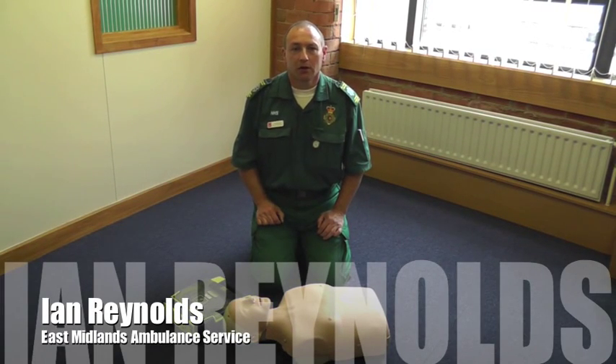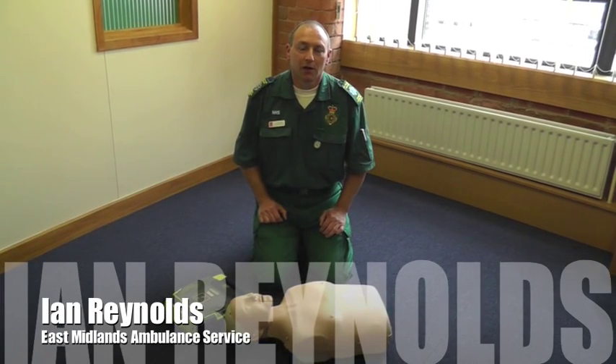I'm going to demonstrate how to use a defibrillator in a cardiac arrest. As you'll see, it instructs you on what to do, and it's a case of just following the instructions.